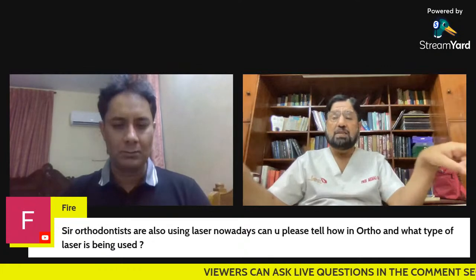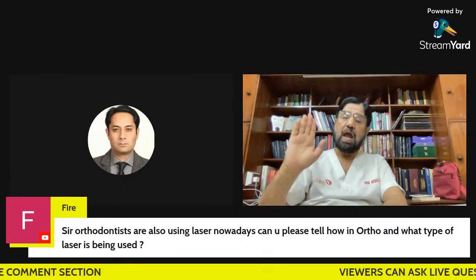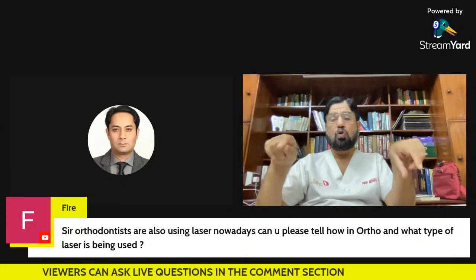Fourth is the photobioactivation of the movement. It has been proven that you apply the orthodontic brackets or clear aligners, place them there, and then give an episode of soft laser daily for a few days. The orthodontic movement which you would get in 15 days, you are going to get in half of the time, because it gives energy to the area, and this energy results in osteoclastic activity, and the osteoclasts move more aggressively and give more space to the orthodontic movement by this laser photobioactivation.